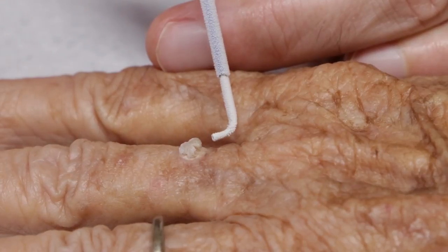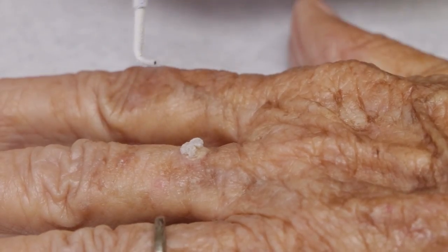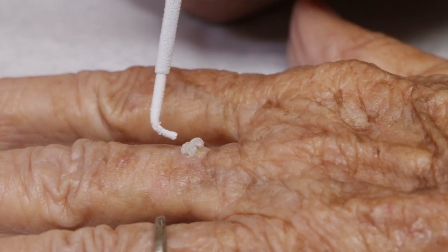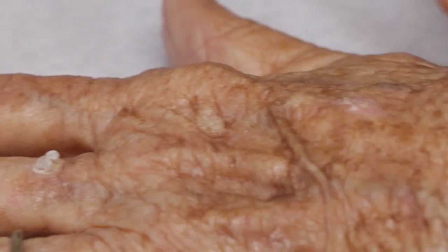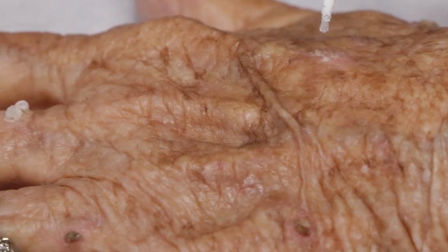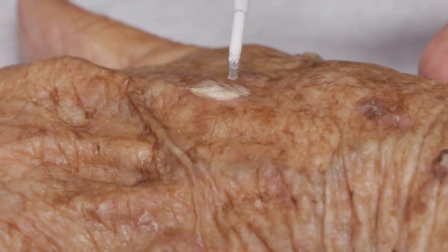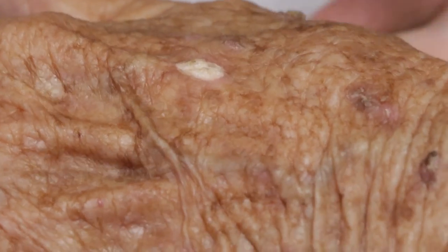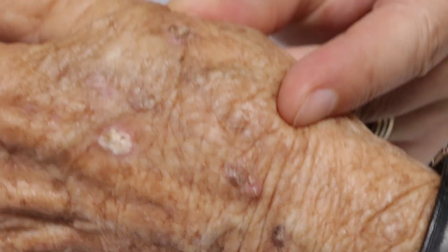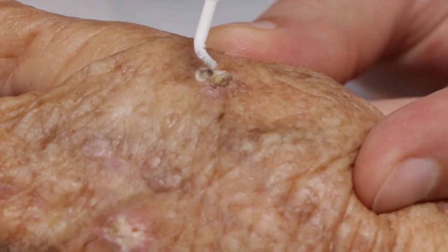We're trying to get the skin underneath it really cold and kill it off — cause frostbite. We'll move on to the next one. There's not as much keratin there so it's easier to get it cold quickly. Then we'll move on to this one. I think I'll kind of turn it up sideways like that — yeah, that works better. Actually there's two of them there, you know that?